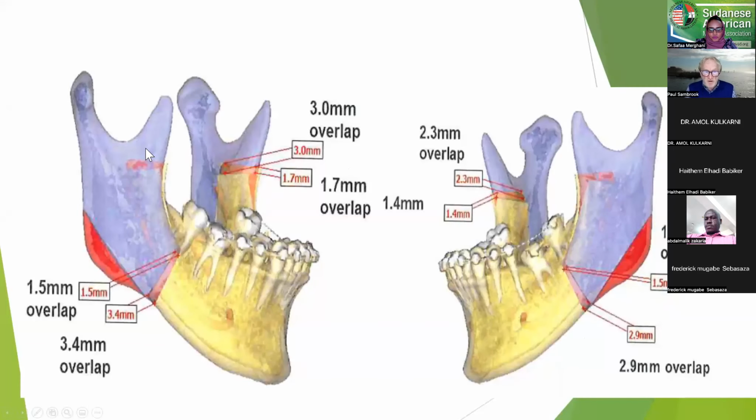Again, you can really remove each of the components and have a look quite specifically, really where the jaws are going to go. Any interferences that you're going to look at, both on the teeth and in the bones. You can make yourself guides as to what you might do to help overcome those interferences or those difficulties during the surgery.